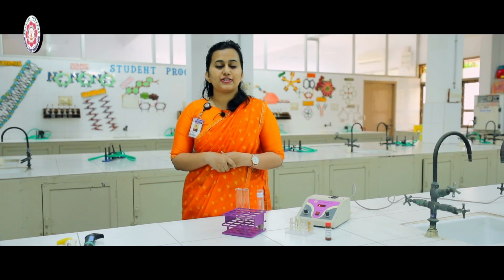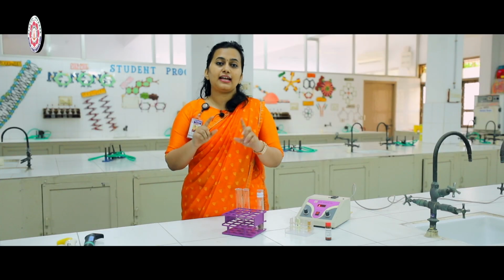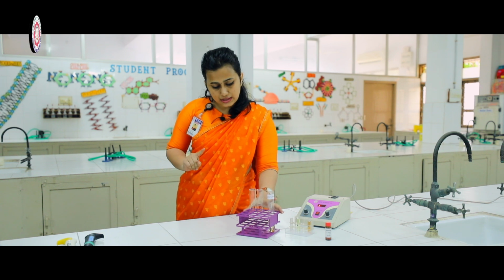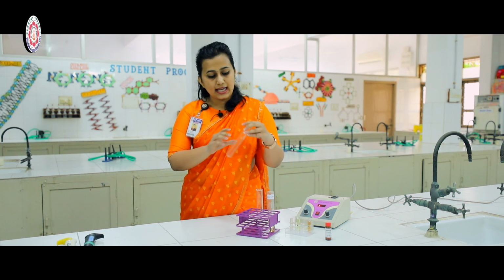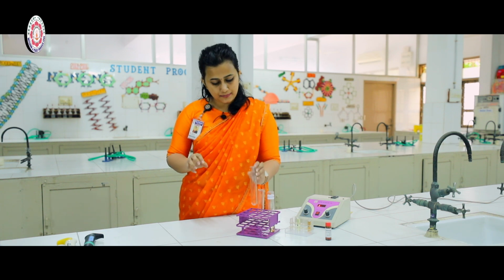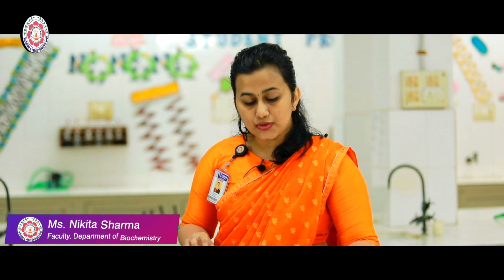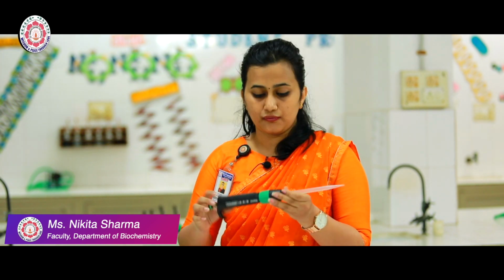Now moving to the procedure, as I already informed you, the only reagent used for this method is Drabkin's reagent, and this reagent contains cyanide, so it has to be handled carefully. We just need two test tubes. I've labeled one as blank and the other as test. To both of these test tubes, I will be adding 5 ml of the Drabkin's reagent.